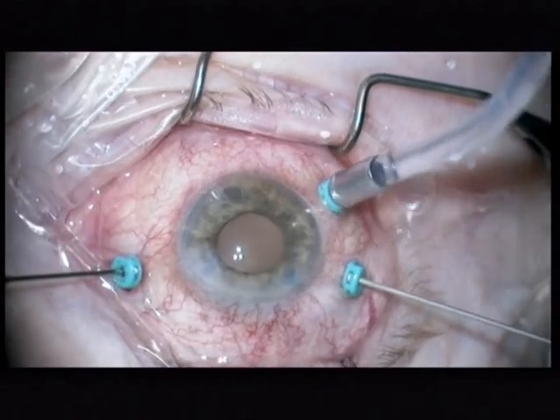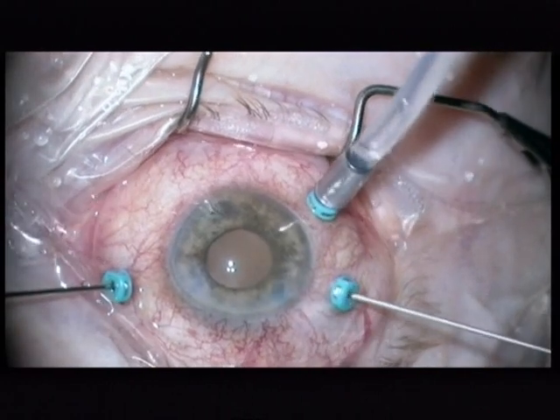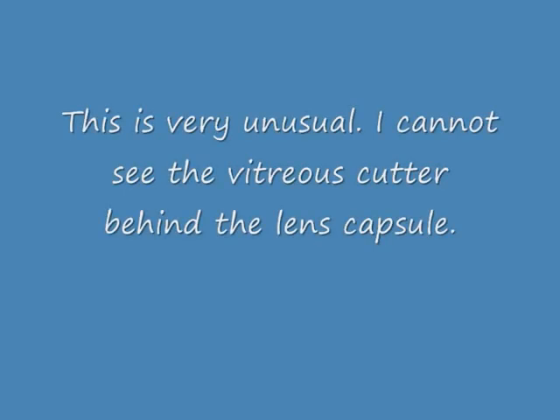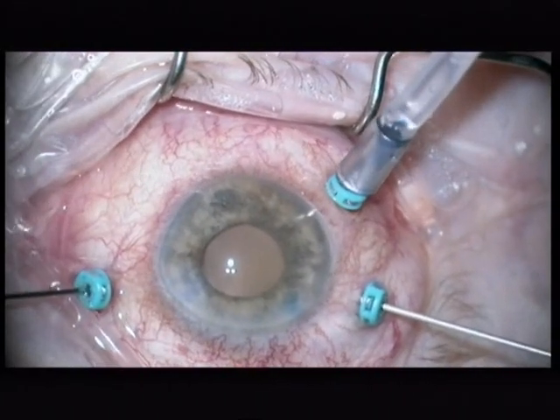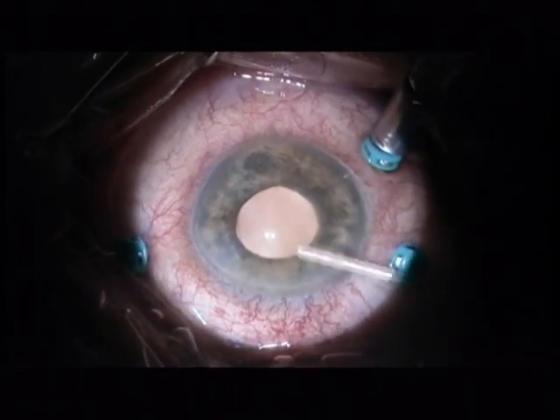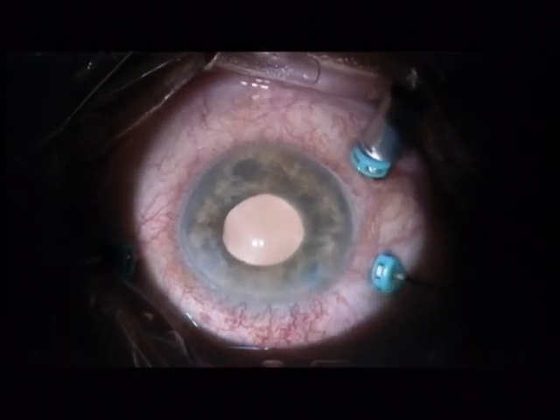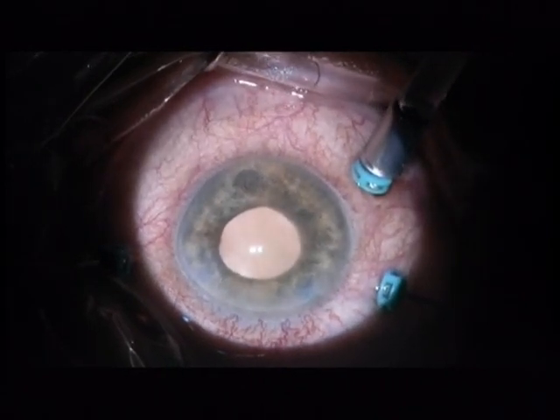And now comes an interesting step. I am trying to do an anterior vitrectomy, but I cannot see the vitreous cutter behind the lens capsule. I am even putting on the red reflex now, but the cutter is not visible. This is very unusual, even in a very dense vitreous hemorrhage.